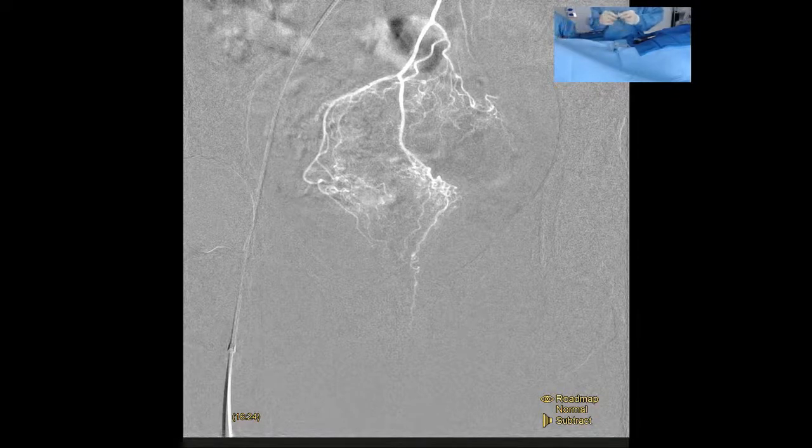So on your previous angiogram, you commented how we were only seeing 2 branches, when there's usually 4 branches. Exactly. So do you think in this image that proximal branch is actually the other two branches? It looks like they may be extending downward towards them. That proximal branching point. Absolutely. Yeah. So once you're 4 centimeters down each of those main right and left trunks, then there are branches that go right down the middle that are probably posterior branches as well.